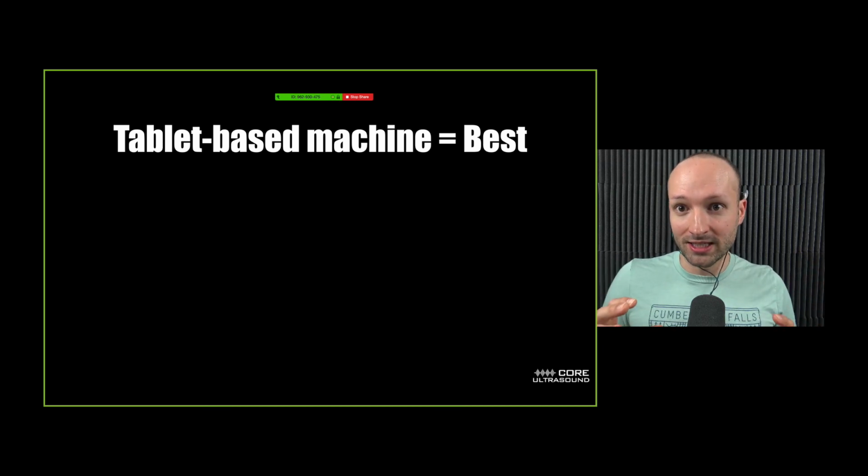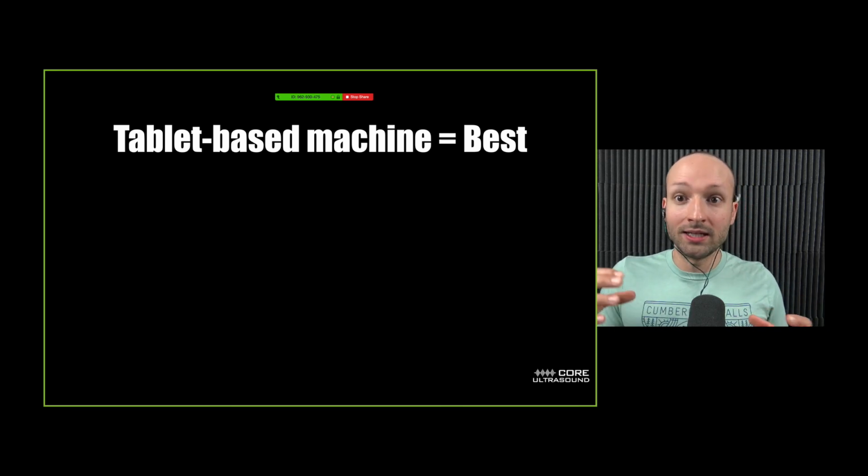So there's a picture. There's this guy out in Vermont named Peter Weimersheimer, who's kind of one of our ultrasound people. And he actually placed his Butterfly with the probe and the iPhone and an iPad mini inside of a sterile sheath, and it all fits. That'd probably be the best way to do it if you can do it that way.